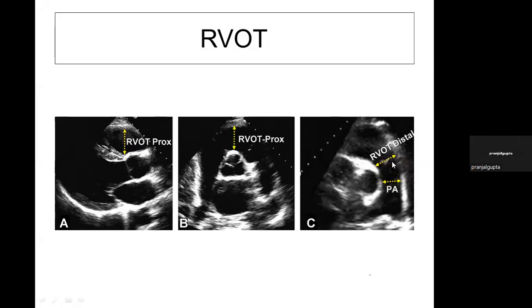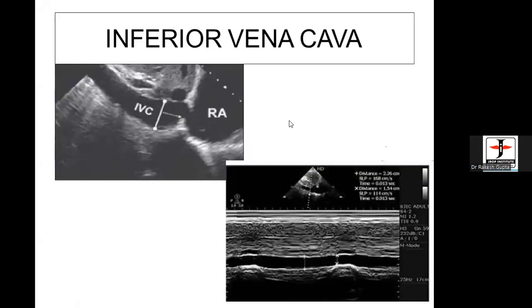I want to know what is the exact place at which IVC dimensions should be measured. Go back, Dr. Nandita, show just distal to the hepatic vein. I'll be showing the dimensions live, just distal to hepatic veins. If you cannot see the hepatic vein, you can take 3 to 5 centimeters. The new guidelines classically say 3 to 4. You can use 3 to 5.